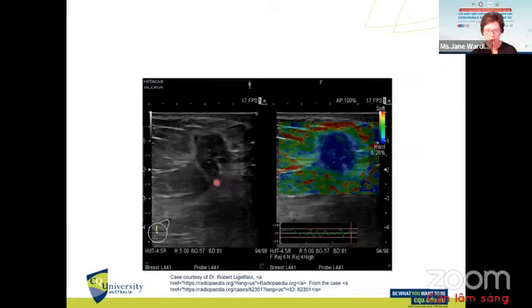It's hypoechoic, but again, it's irregular, and it's not homogeneous through here. We can see brighter echoes and darker echoes, and even a tiny little cystic component in here. We've got that white line or the halo around the mass there again.